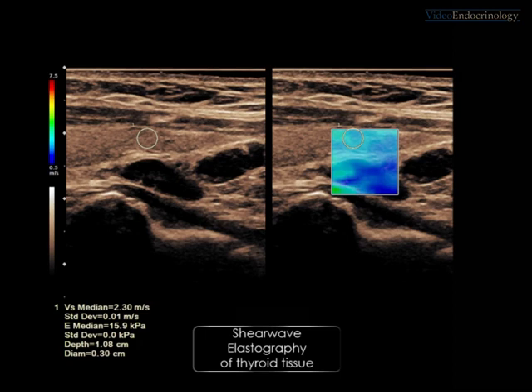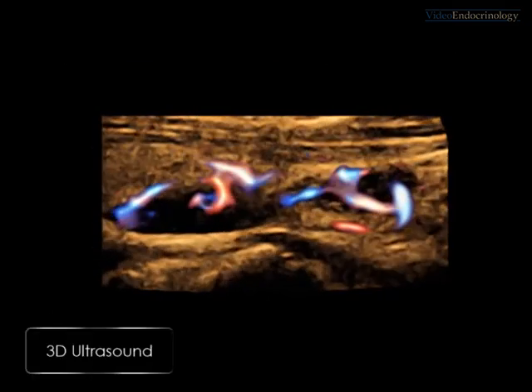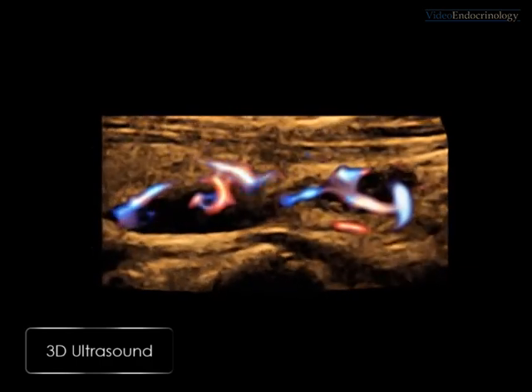This elastography exam showed the right neck lesions to be soft. 3D ultrasound exam demonstrated a polar artery in both lesions.